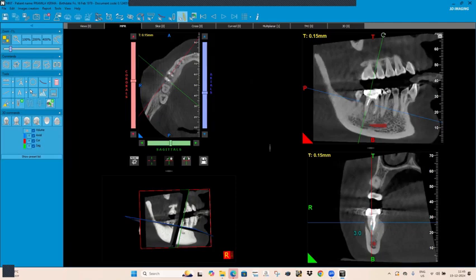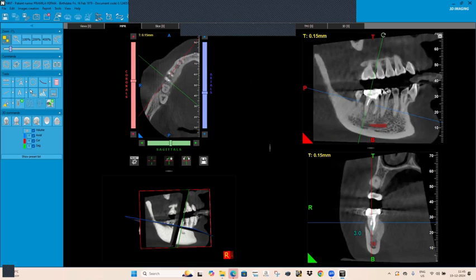Madam, is there any tool in the app where we can come to know the volume of the pulp? Volume can be measured, like we can measure the width, but there is no tool as such for volume. We can measure only. I understood we can measure, but we can always measure in 2D directions only.